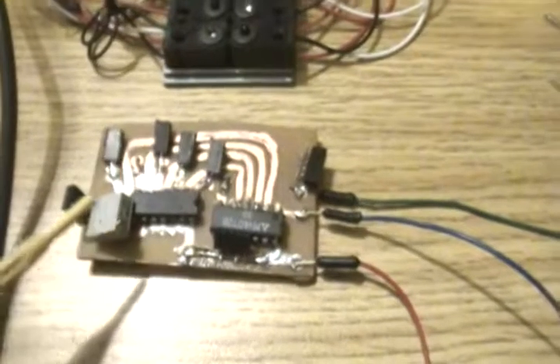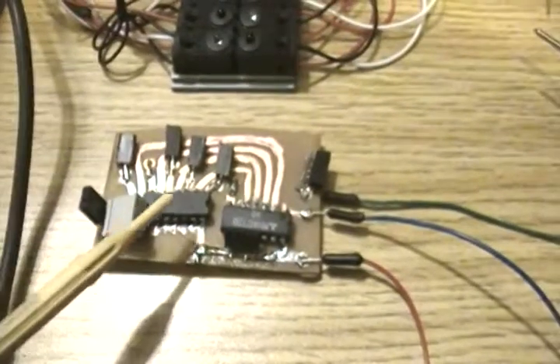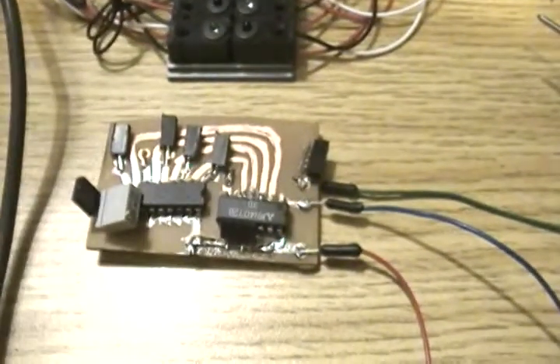This is a potentiometer, and you use it to vary the intensity of the LED in order to get closer or further from the threshold of the trigger here. This is very important to adjust the device to make it sensitive to the drop.